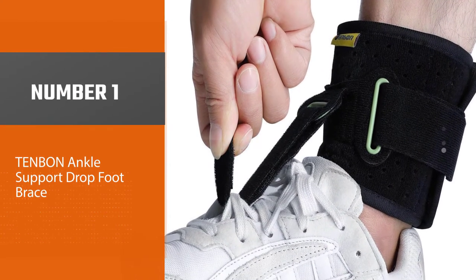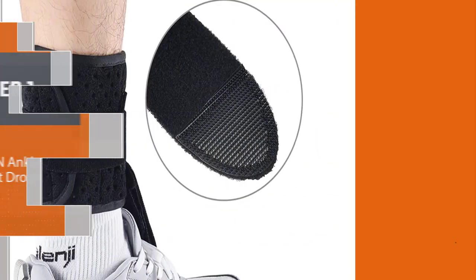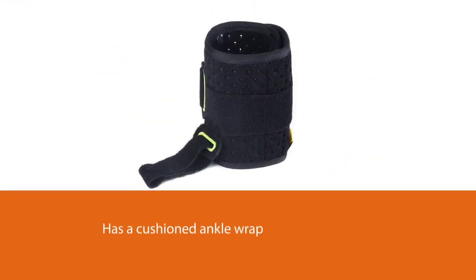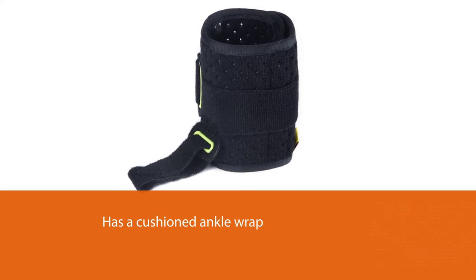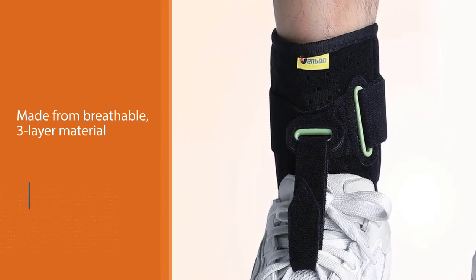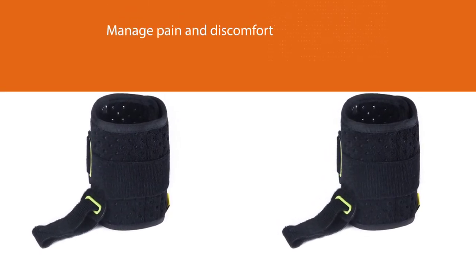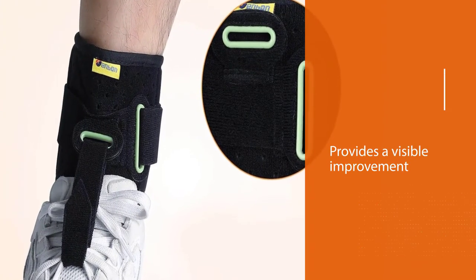Number one, best overall: Tenban ankle support drop foot brace. The Tenban ankle support AFO brace is made of velvet fabric, sponge, plastic sheet, and nylon tape. It has a cushioned ankle wrap made from breathable three-layer material that can be worn for longer periods. It manages pain caused by post-stroke foot drop, plantar fasciitis, achilles tendonitis, Charcot-Marie-Tooth disease, diabetic neuropathy, muscular dystrophy, and more. It also provides visible improvement in gait.